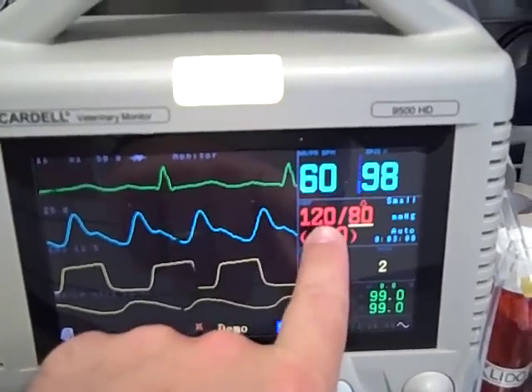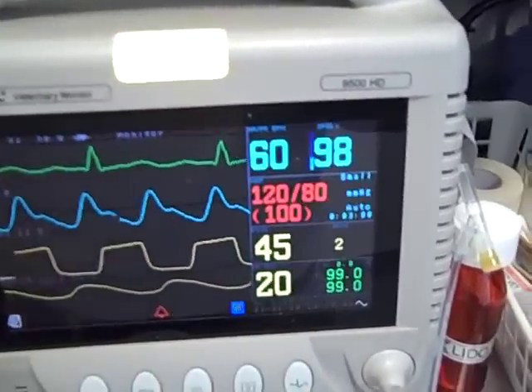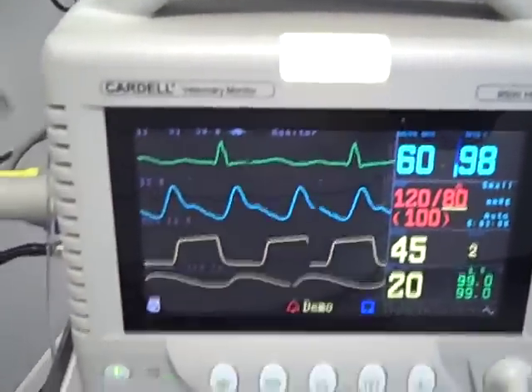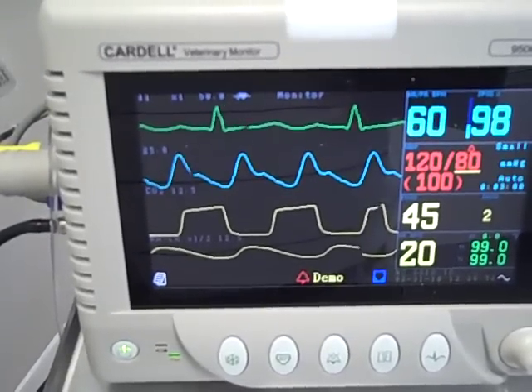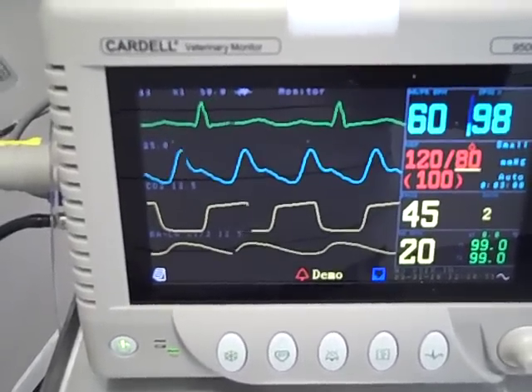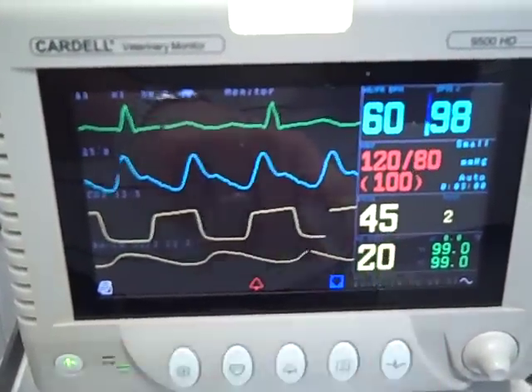Over here we have blood pressure measurement — the systolic and the diastolic along with the mean in parenthesis. This is an end-tidal carbon dioxide, or capnograph, that gives us information as far as how adequately the lungs are ventilating — taking in oxygen and expiring carbon dioxide — along with the end-tidal carbon dioxide measurement.